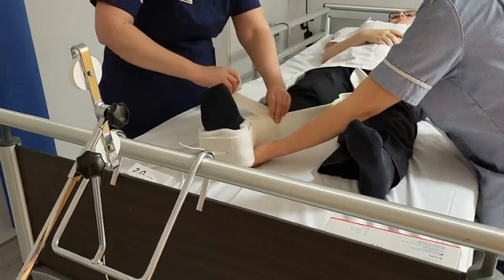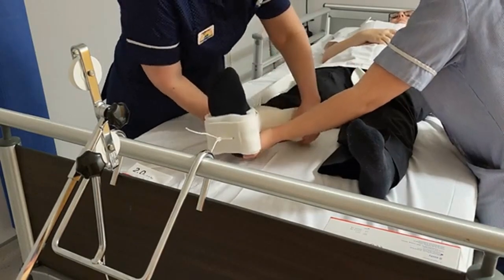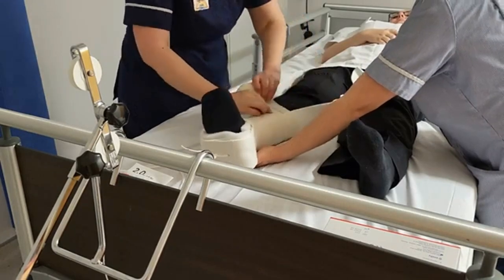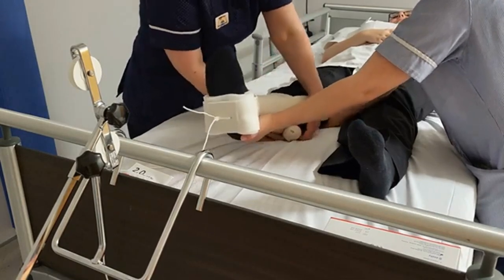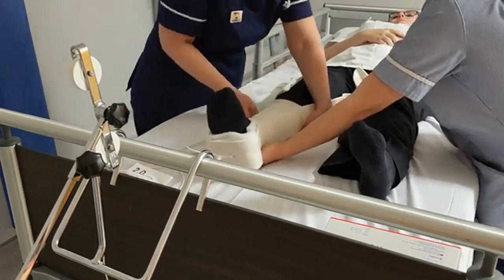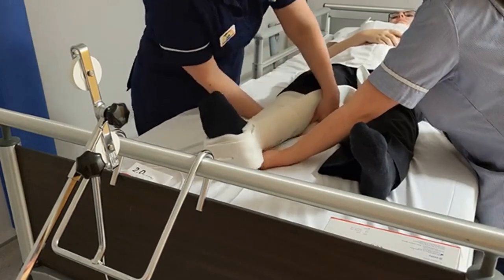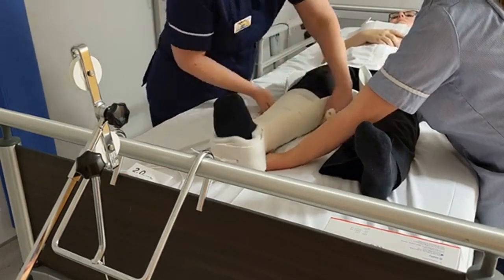The child will have been well analgesed with paracetamol, ibuprofen, oramorph. You could use gas and air or intranasal diamorphine if required. The use of a play specialist is really helpful for distraction to ensure the child is comfortable and reassured. We will have given the parents explanations of what we're going to do, perhaps giving them a copy of the child in straight leg traction leaflet so they know what to expect before the traction is applied.